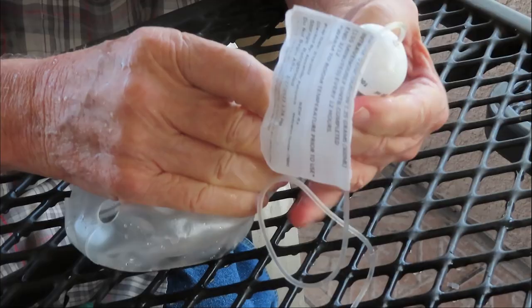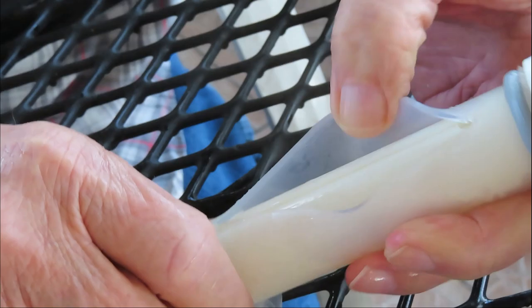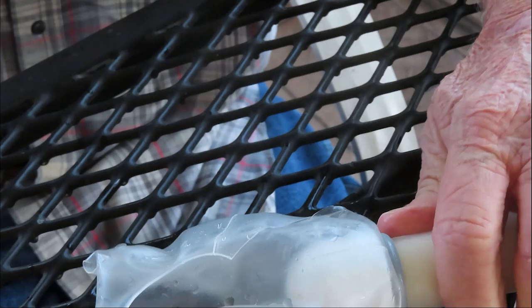And the pipe itself, it's got a split as you can see right here. I assume that's where the liquid comes out into the bag and then pushes back in. This probably inside here is a filter. I have no clue what's in there yet. And I know it's glued, so I don't know how much pain to get it off, if I can or not real fast.